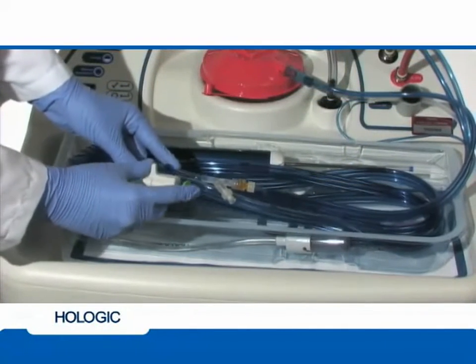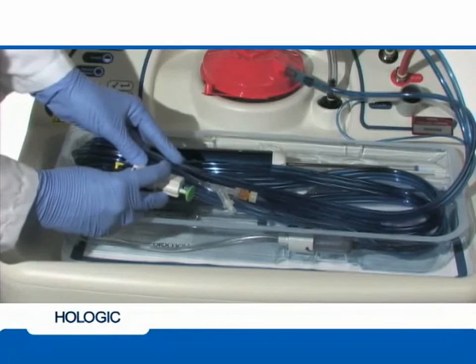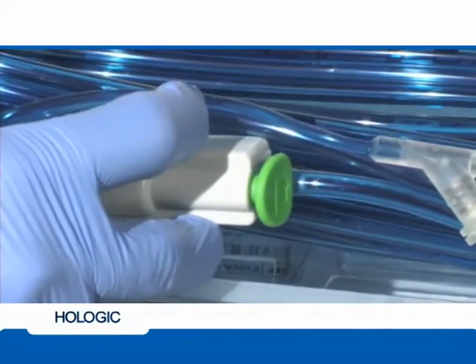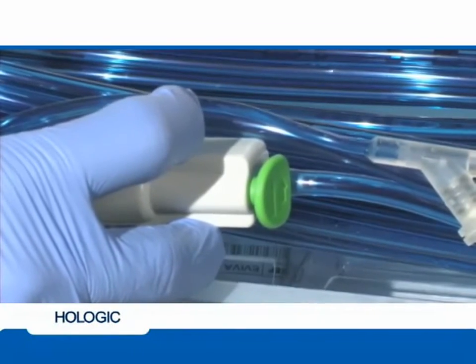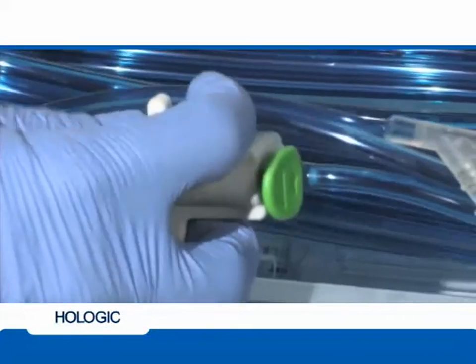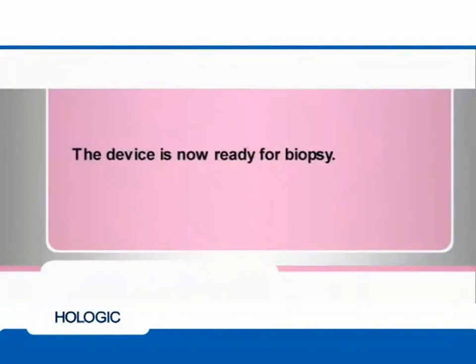Using the remote valve, prime the device by depressing the white button to put the device in the pre-fire position. Depress the green button on the remote valve to fire the device while the device is still in the tray. Return the device to the pre-fire position by fully depressing the white button on the firing mechanism. The device is now ready for biopsy.